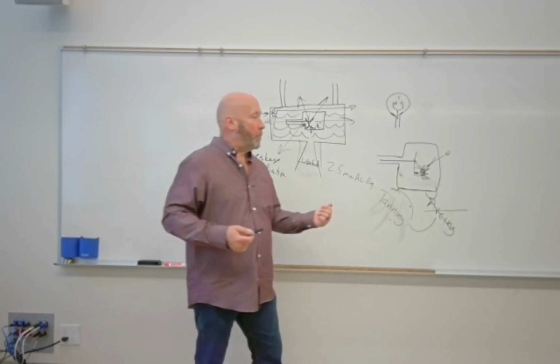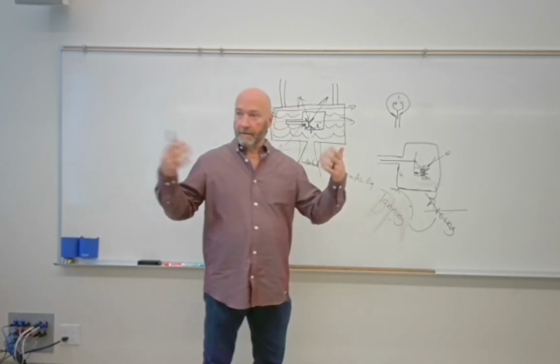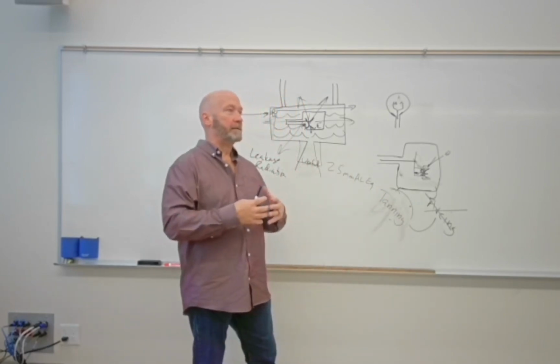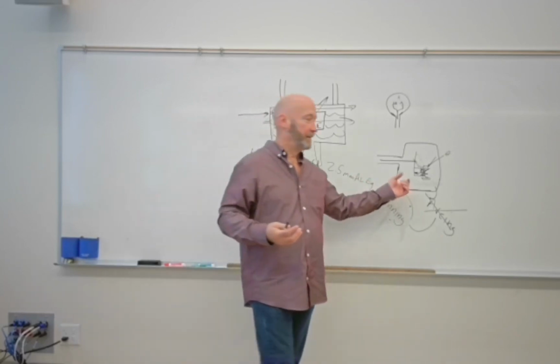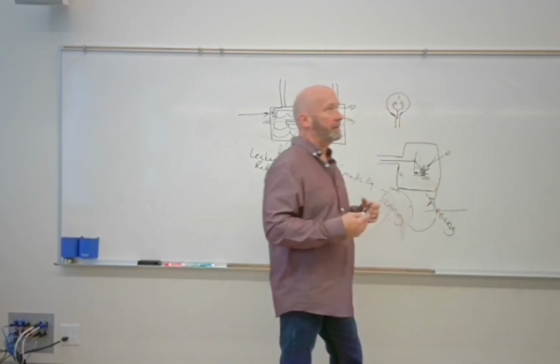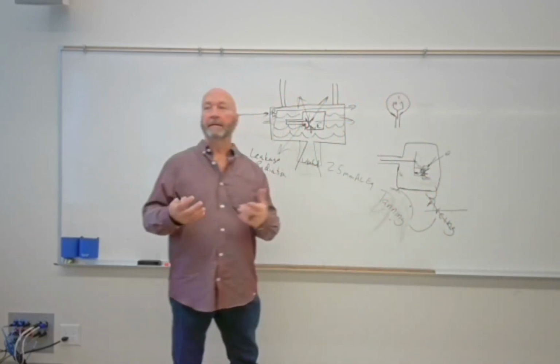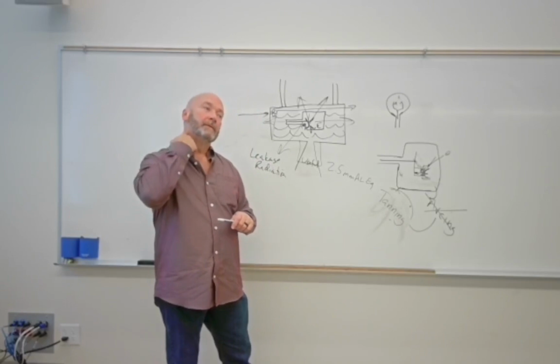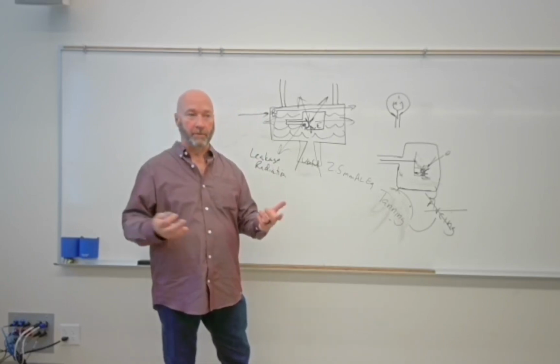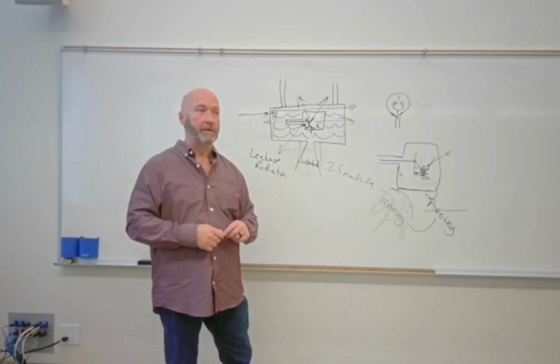What we don't want, because we're imaging people, is that to happen with our filament. So tungsten has a semi-unique ability to maintain its shape regardless of how hot or cold it gets. It doesn't distort well. It doesn't distort much at all.